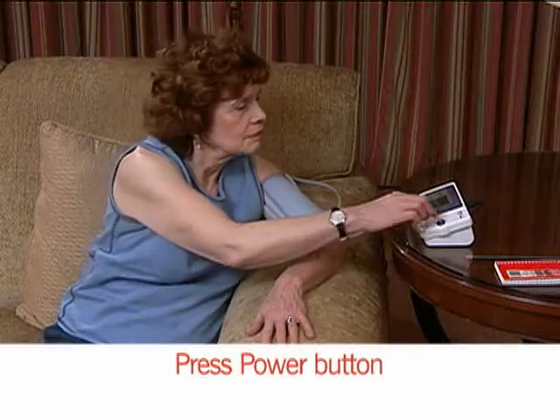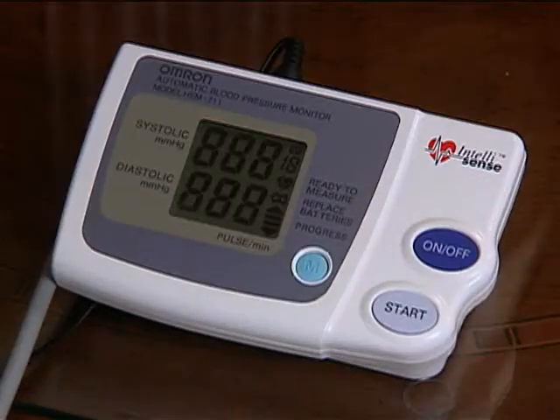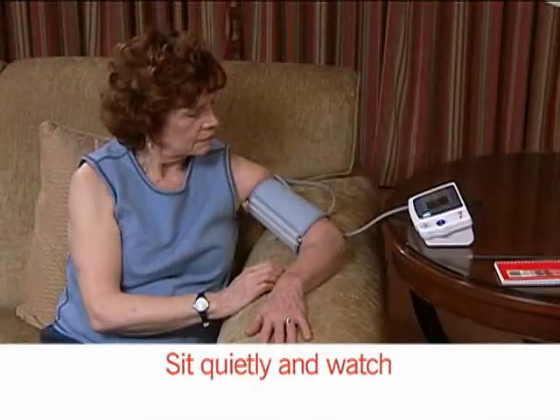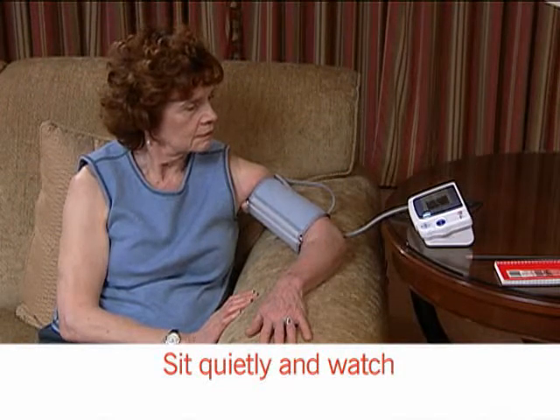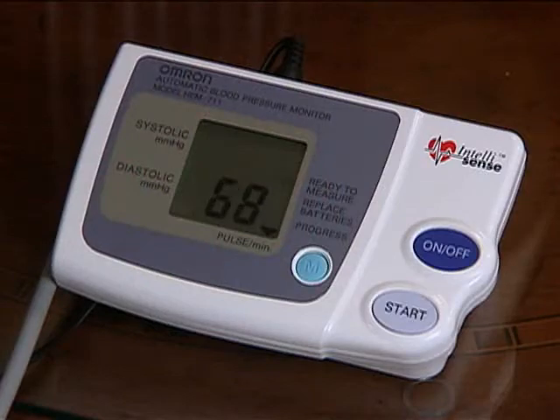Next, press the power button. All display symbols should appear briefly, followed by a 0. This indicates that the monitor is ready. Sit quietly and watch the monitor. Blood pressure readings will be displayed on the screen. On some devices, values may appear on the left, then on the right. Most devices will also display your pulse rate.